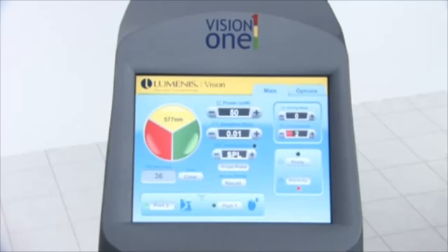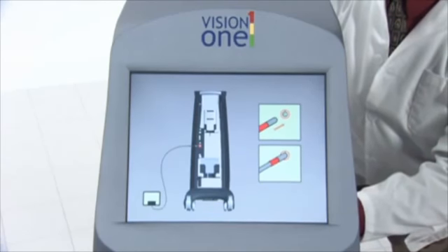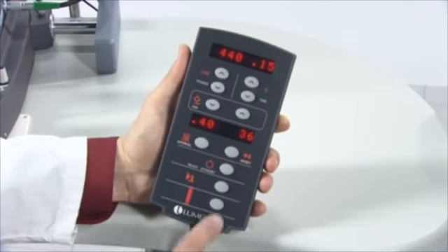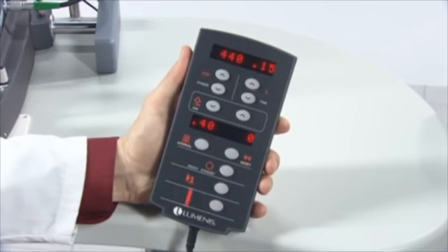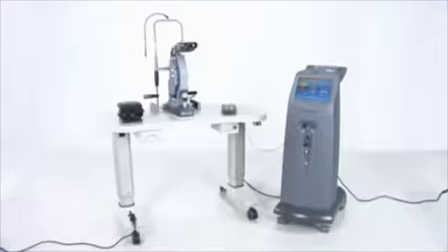If these measures fail to solve the problem, refer to your operator's manual for a comprehensive troubleshooting guide. Advisory messages periodically display on the control screen and remote control to alert you to a necessary action or to a laser malfunction. On the control screen, advisory messages display as text icons and/or error codes in the lower right-hand corner of the screen, as shown, or as instructional procedures on a separate screen. On the remote control, error codes appear in the pulse counter display. See your owner's manual for a comprehensive guide to advisory messages.